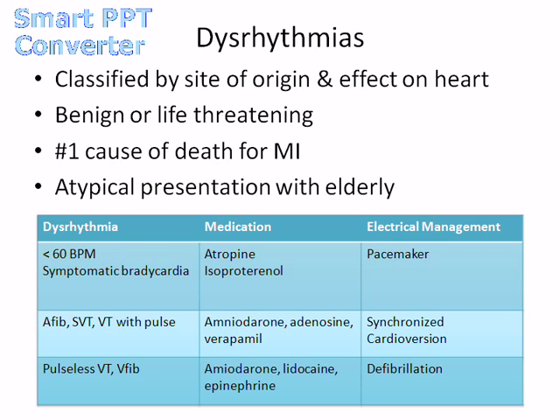Pulseless, or pardon me, ventricular tachycardia with a pulse. If we have PVCs 3 in a row or greater, that is called a run of VTAC. Typically, we're going to report a run of how long. Like they might have a run of 6 or 7 in a row. Sometimes the patient doesn't even feel it or know that it's happening, but we can see it on the monitor. Those are also treated with the amiodarone, adenosine, and verapamil.